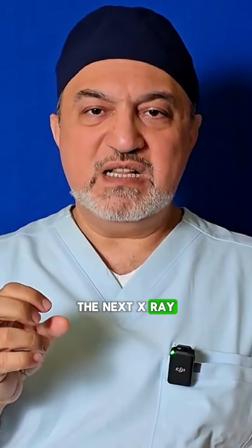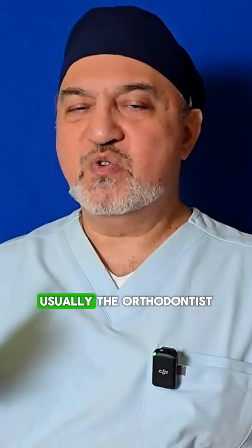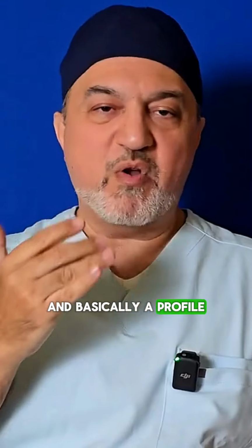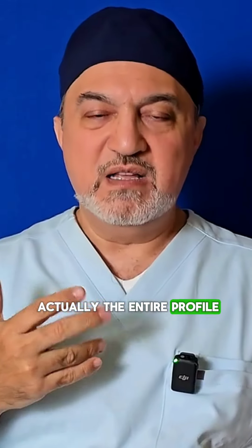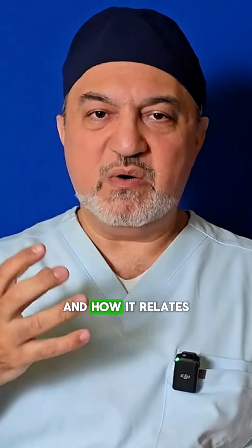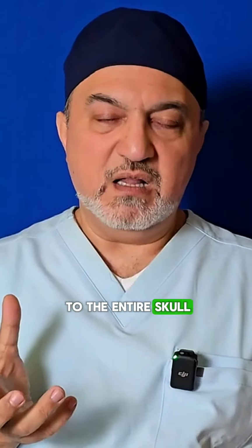The next x-ray that we have is called cephalometric. Usually the orthodontists take that. That is a side view of your face and basically a profile x-ray, the entire profile. And that also shows the relationship between the upper and the lower jaw and how it relates to the entire skull. There's also three-dimensional x-rays.